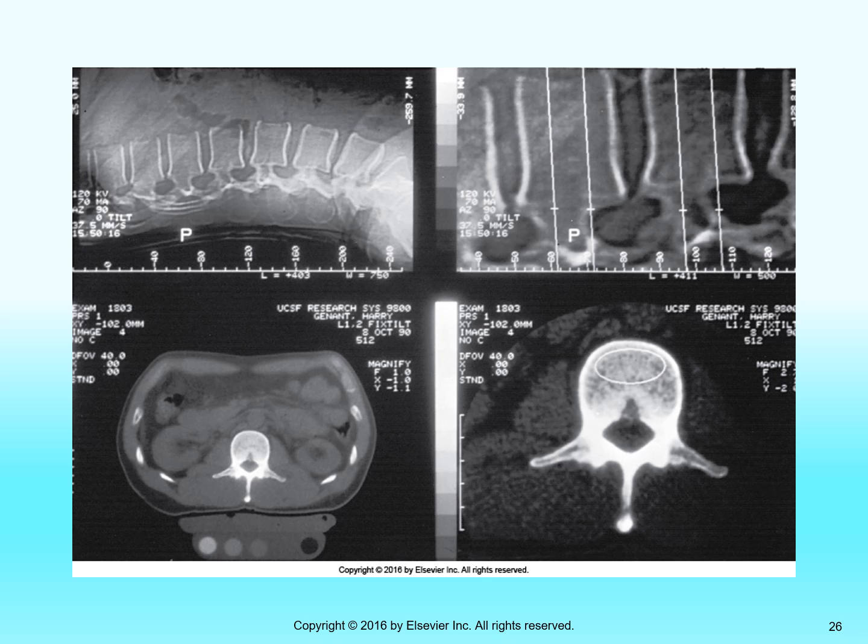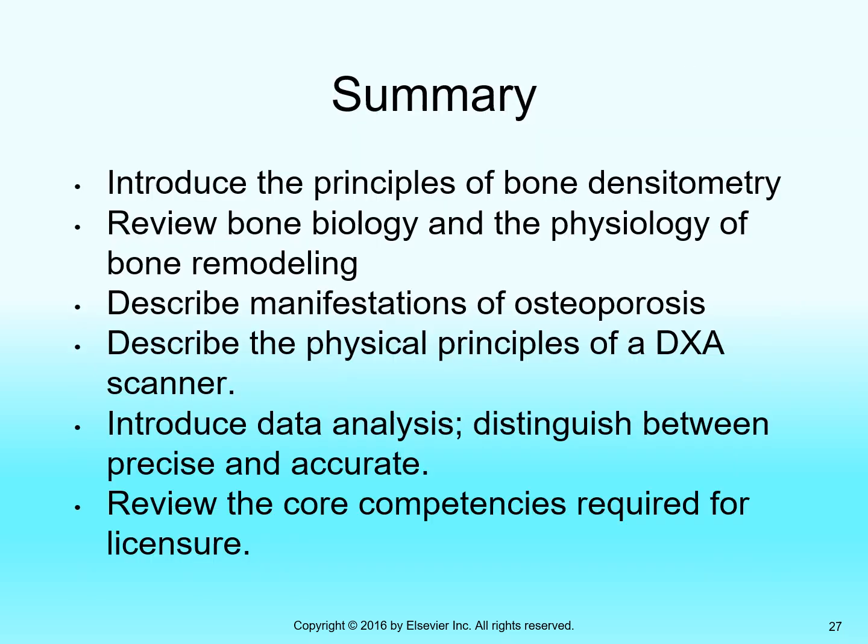There's no reason you wouldn't be able to. So whatever a bone densitometry unit can do, a CT scanner could do. You just have to have the right software installed on the CT scanner in order to run the calculations you need. It's a given with every bone densitometry unit that it can do that because that's the point of the machine. A CT scanner is to do CT scans. If you want to do bone densitometry, it's usually a software add-on to a bare bones unit. So that's bone densitometry in a nutshell.